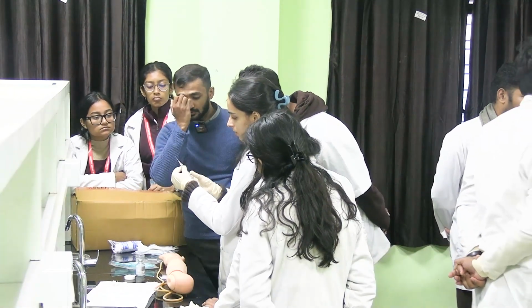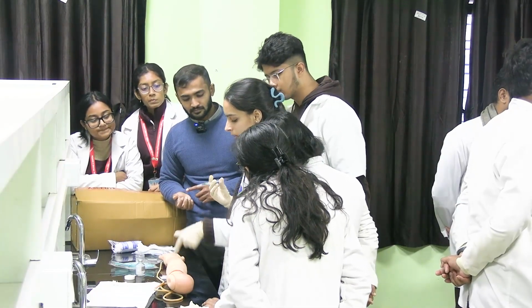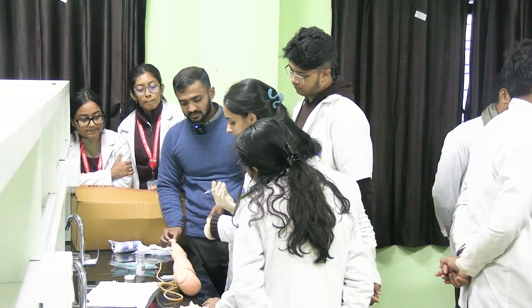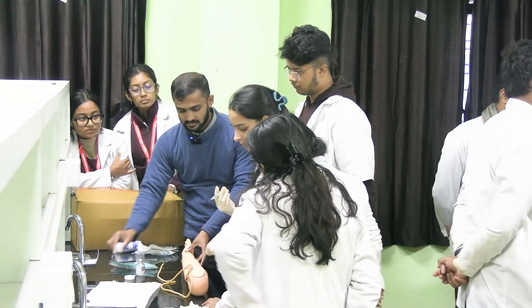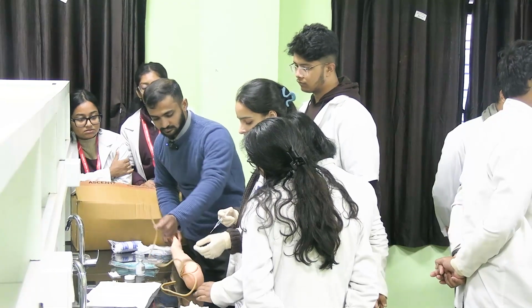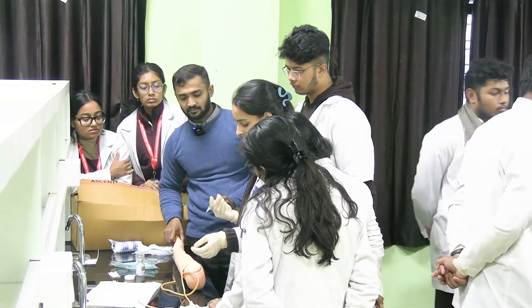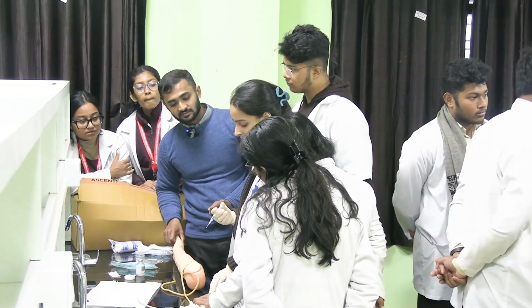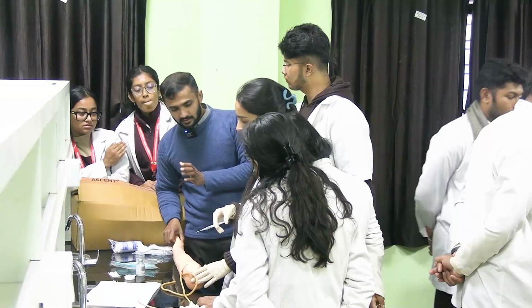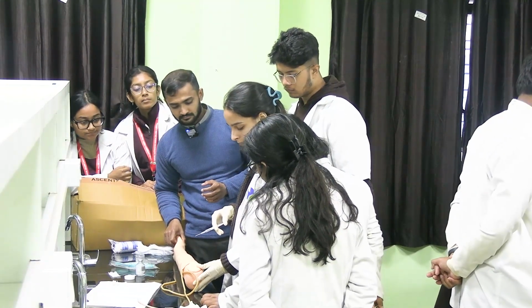Can you see? So now what is the next step? We will inject. But before injecting, what are the things? For IM, which technique should be used? That is known as the Z-track technique. So what is the Z-track technique? You have to laterally pull or shift the skin. How will you pull?